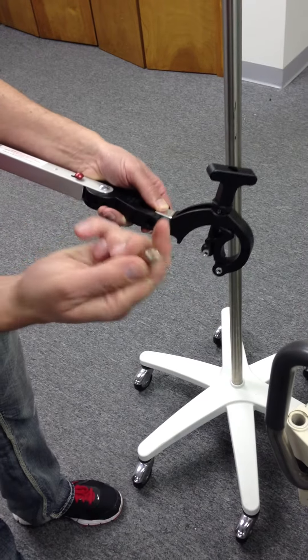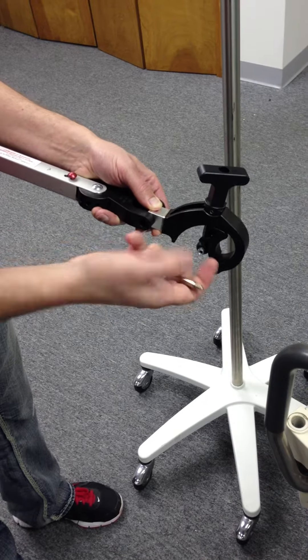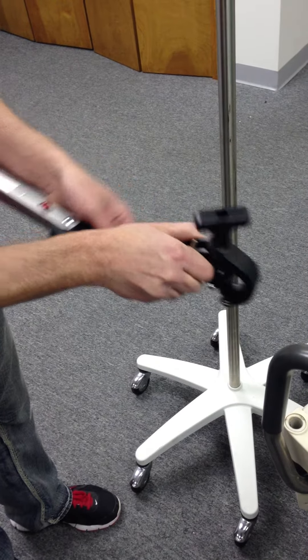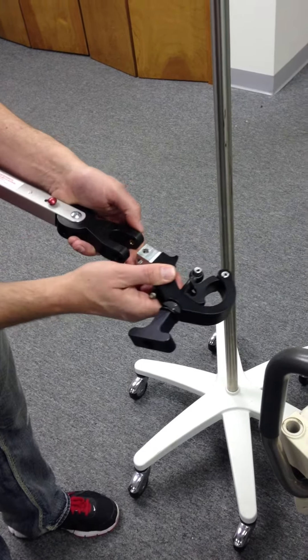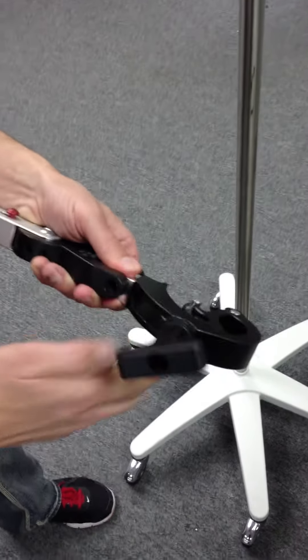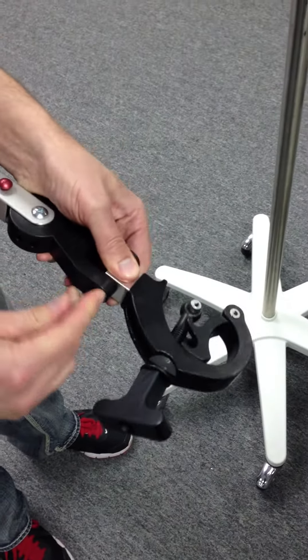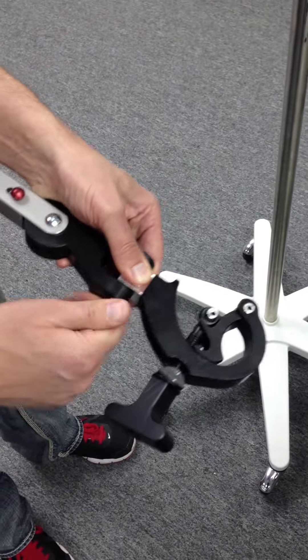So you basically loosen the bolt, take the bolt out, take the clamp, turn it, then slide your bolt back in here.